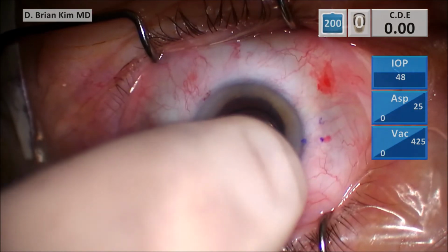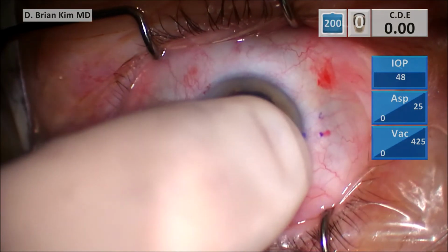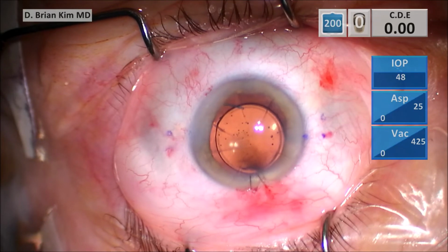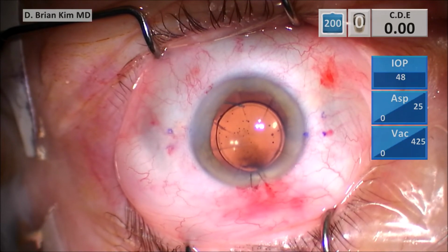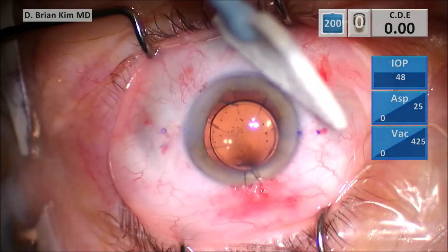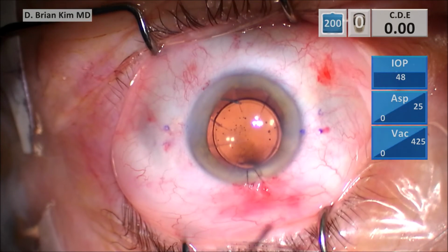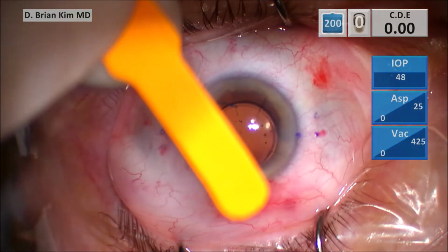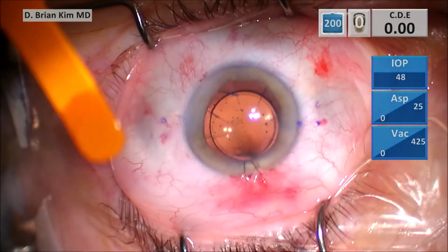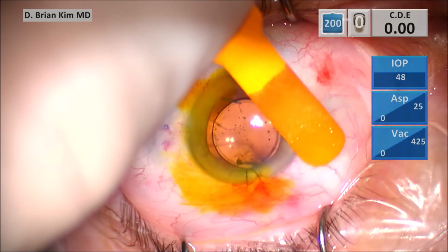But again, as you saw, there was still a little bit of vitreous, even though this patient's had a vitrectomy in the past. So I put some triamcinolone in, made sure there's no vitreous in the AC. Go ahead and did some vitrectomy. But remember, what did I do? I took that trocar out because it's a very poor ergonomic location, but it's a self-sealing incision. It went quickly. I was able to pull it out, placing the trocar needle back in, pulling the actual trocar out, and then repositioning into a place where I can access it better for the vitrectomy.